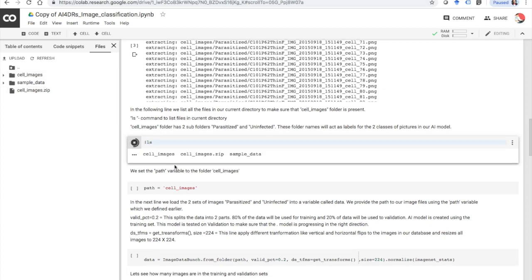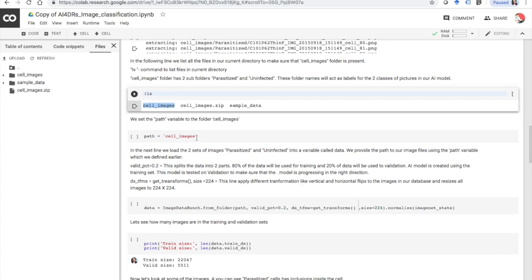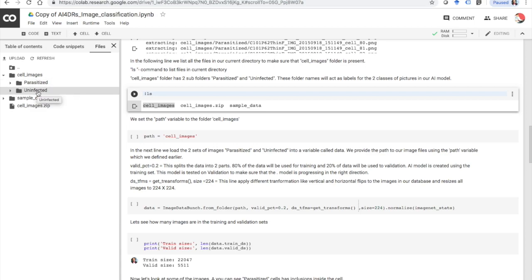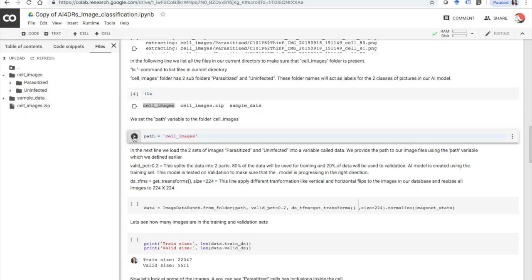Now let's run this folder. We are going to set a path variable to the folder where the cell images are. If you click that folder you can see two subfolders: parasitized and uninfected. The parasitized folder has images of cells which are infected with malaria, and of course the uninfected folder has images of cells which do not have the malaria infection. Now let's run this cell.